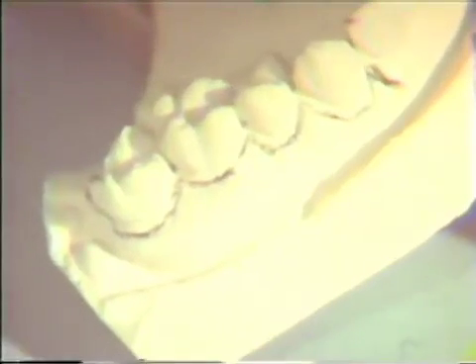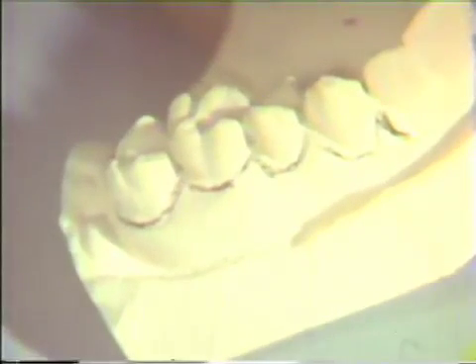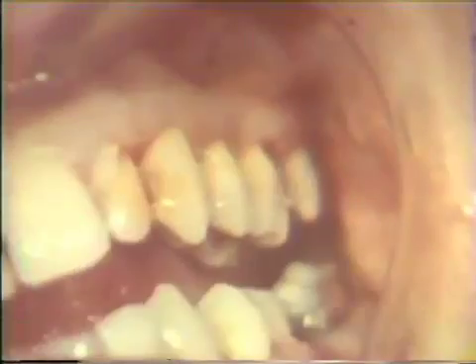The palatal incision has been outlined. The exaggerated scalloping effect around the molars will permit the buccal and lingual flaps to be drawn together interproximately. Also note the outline for the distal wedge incision. The buccal incision is outlined one-half millimeter to one millimeter from the free gingival margin to assure complete removal of the epithelial lining in the buccal crevices. Note the vertical releasing incision between the cuspid and lateral incisor. Iodine lotion is applied to the pockets and the mucosal membranes to minimize the bacterial flora in the field of surgery.